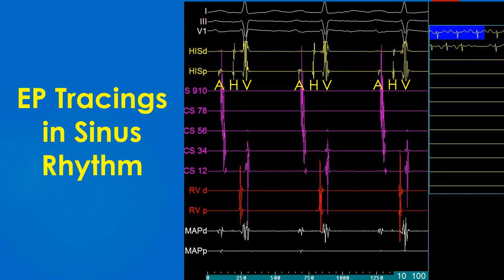The earliest atrial activity is in the surface lead V1. The atrial activity in the His electrode comes after that, followed by the proximal coronary sinus electrodes. Distal coronary sinus electrodes pick up the atrial activity later, reflecting later activation of the left atrium. The distal coronary sinus electrodes also show ventricular activity, which is more delayed than the ventricular activity picked up by the right ventricular electrodes RVD distal and RVP proximal. The mapping or ablation catheter picks up atrial and ventricular activities and a tiny His potential. The distal mapping electrode Map D picks up a fractionated atrial electrogram, a tiny His potential, and a relatively smaller ventricular electrogram. These types of electrograms are obtained while mapping the potential site for slow pathway ablation, which is between the His bundle catheter and the coronary sinus catheter in the posterior approach for AVNRT ablation.